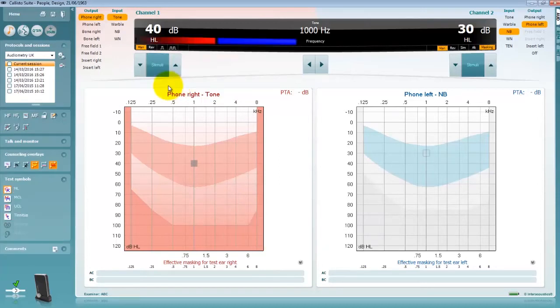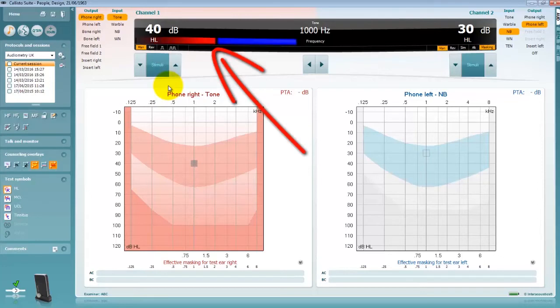The patient's response via the response button is displayed in the software via a light in this location.